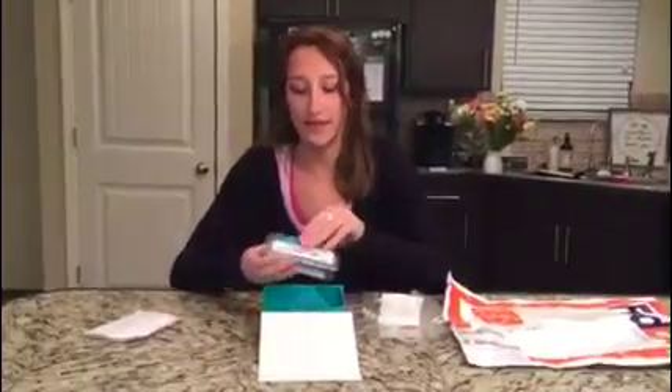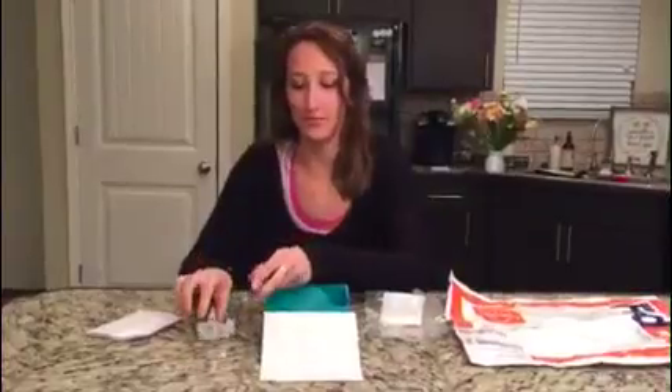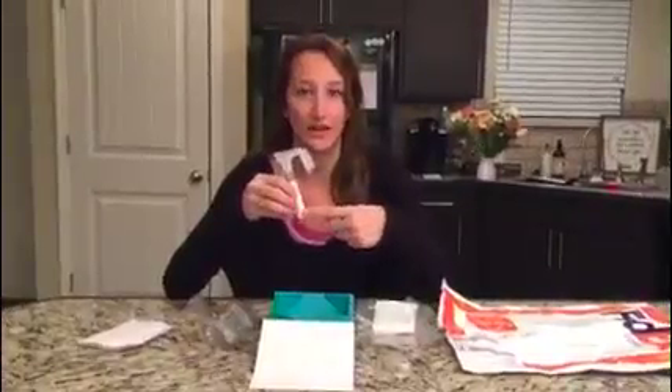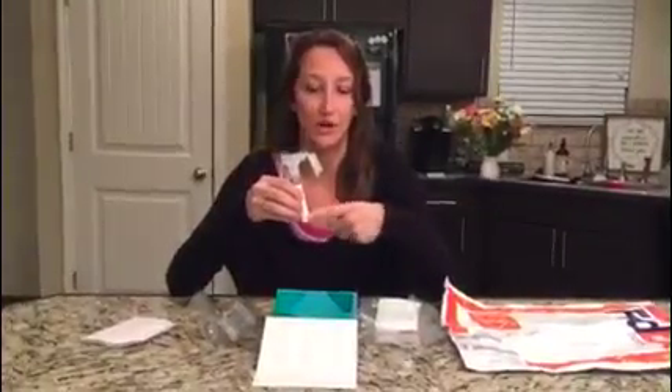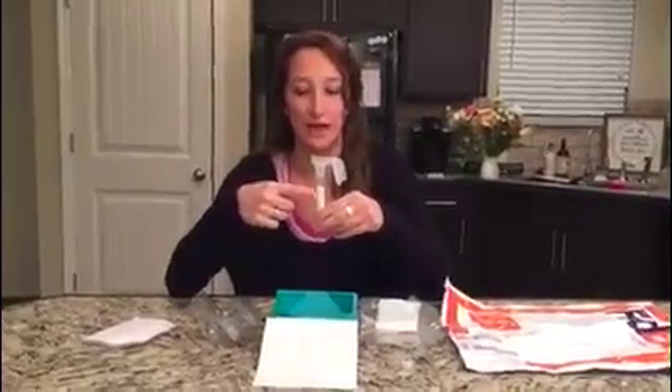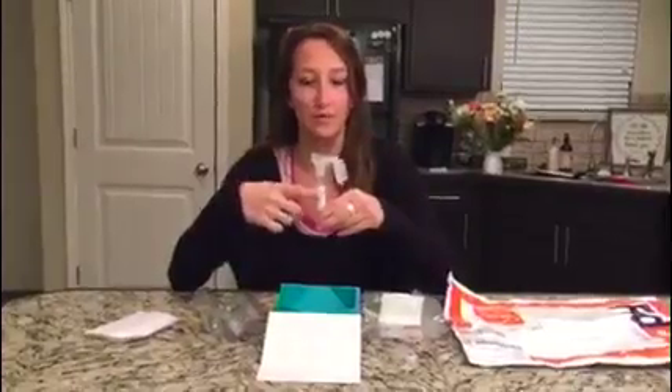With the saliva kit you're just gonna open it up — there are a couple pieces in here. First, the tube that you collect it in, and then a cap that you'll use to seal it off. Your first and last name and date of birth should be on the tube; if not, just write that on with a sharpie. You're gonna want to spit in here all the way up to the fill line, not bubbles, and it shouldn't take more than five minutes.